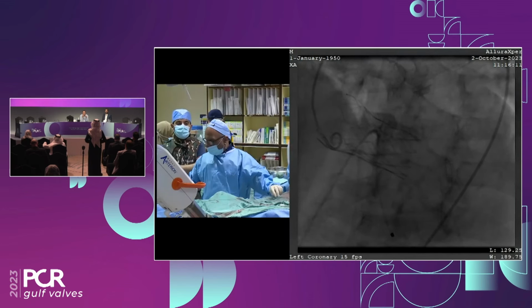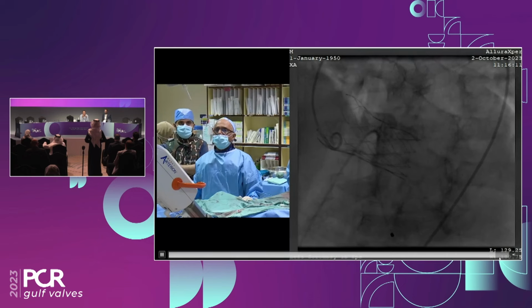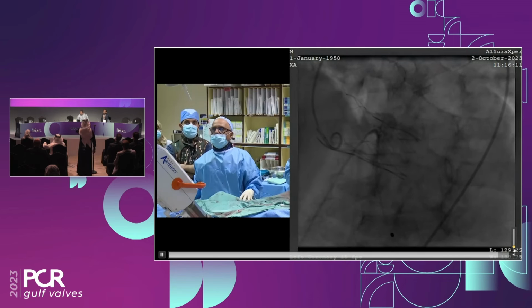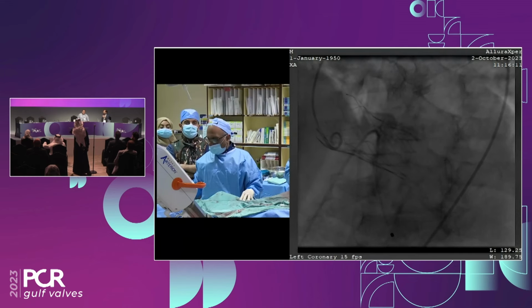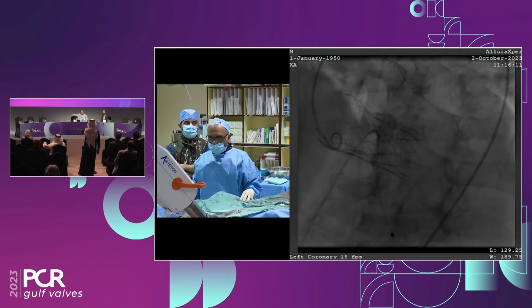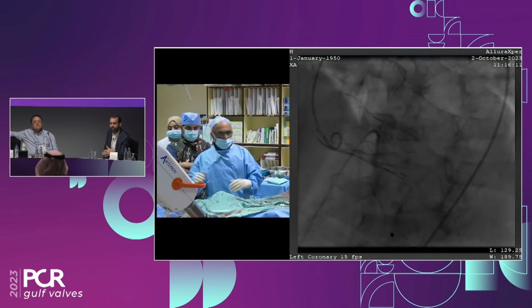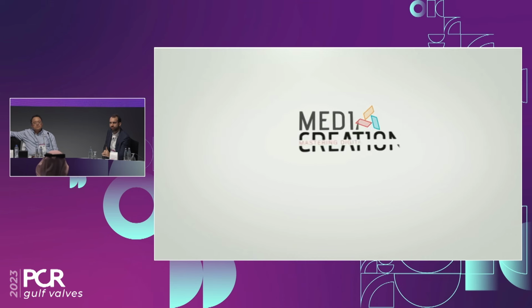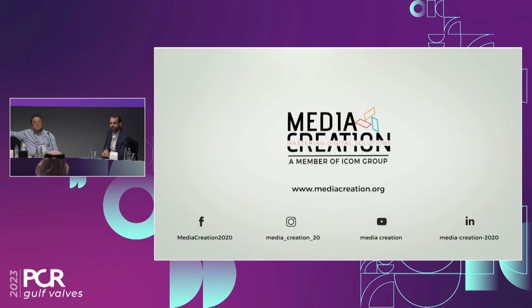To conclude, we finished this challenging case, the horizontal aorta with severe aortic stenosis, a patient at high risk for surgery, and we implanted this valve. It has this NaviSeal technology. The old Portico did not have any skirt. With the NaviSeal, in the trial, it decreased the rates of PVL tremendously. If you see their movie and how they demonstrate the NaviSeal, you will be so happy. It opens in diastole. This is the only platform with this type of seal.